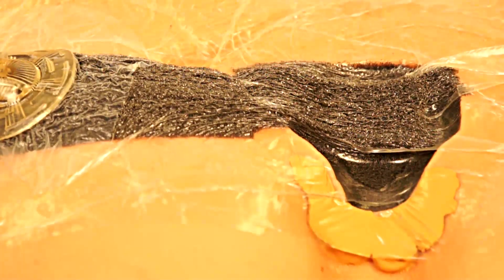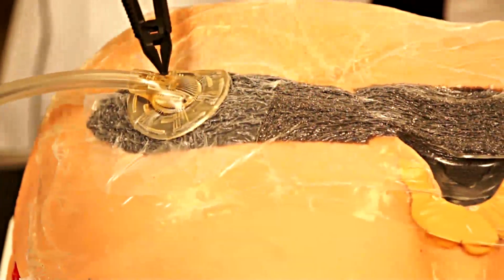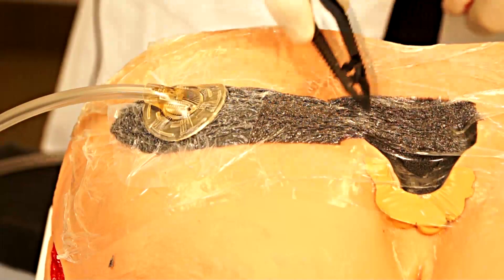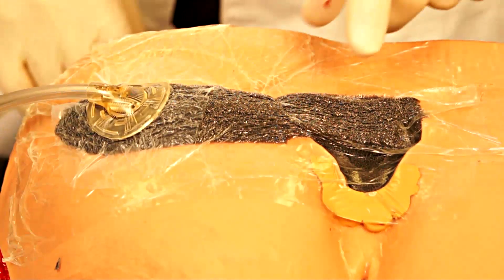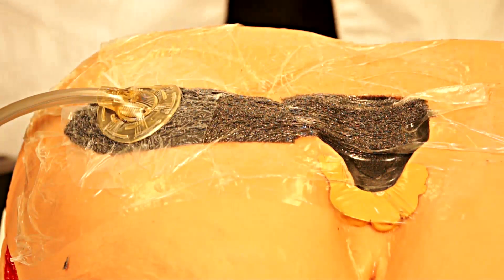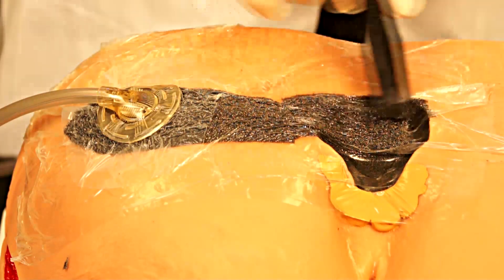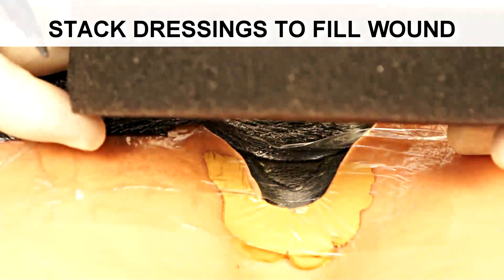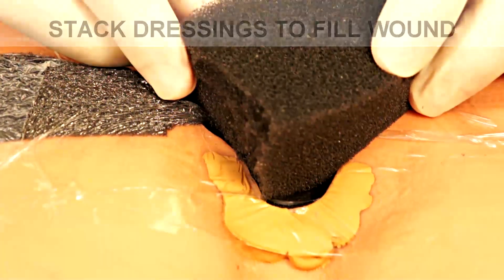As you can see here, our dressing has negative pressure attached to it. The bridge has collapsed and been suctioned down, as well as the sponge which is in the wound itself. This is the appearance you would see with a well-sealed, well-constructed primary dressing with a bridge created off to the side. Once negative pressure has been applied, this particular wound now has a concave or indented appearance. If you have wounds that have significant depth and are deeper than the thickness of your sponge, you can create two layers of dressing by stacking one sponge on top of the other.